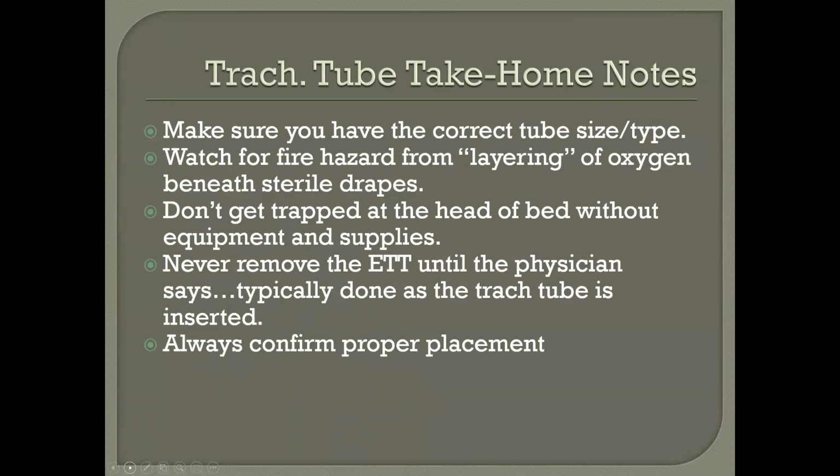At some points, you are using 100% oxygen and letting air out of the cuff of the endotracheal tube, meaning that 100% oxygen is now emanating from the patient's airway in some manner. At the same time, the physicians many times are using electric cauteries, so they have an ignition source.